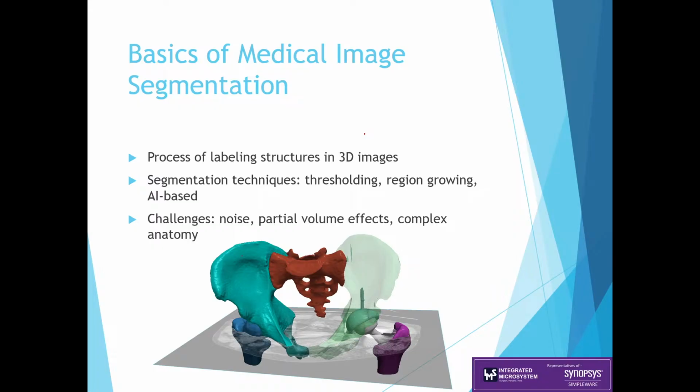In Simpleware, thresholding is further divided into three parts: the profile line tool, a histogram, and a normal threshold tool in which we have automated CT presets that can be directly used to do the segmentation. Even after segmentation, some parts may be missing because they may have a different contrast level but still be part of the existing data set.